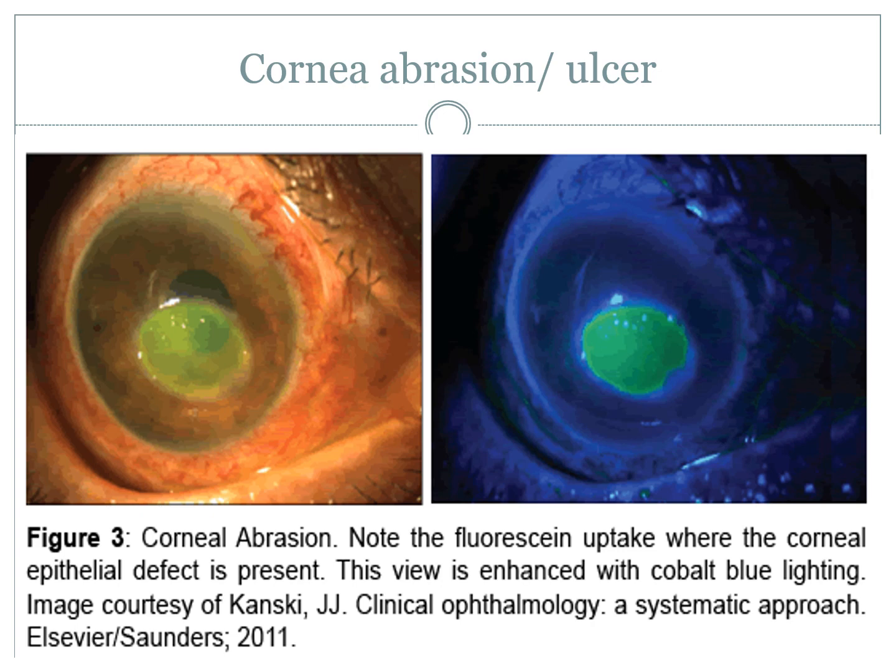It's done pretty much the same way, where you put Fluorescein in the eye, and any areas of corneal defect, if you imagine it down on a cellular level, you're going to have a cavity in which the cornea is no longer uniform. So you no longer have that surface tension across the eye because there's some sort of demarcation within the cornea. This will cause the Fluorescein to pool within that area, which makes it very easy to see, especially under a cobalt blue filter, as you can see on the right side of the picture.